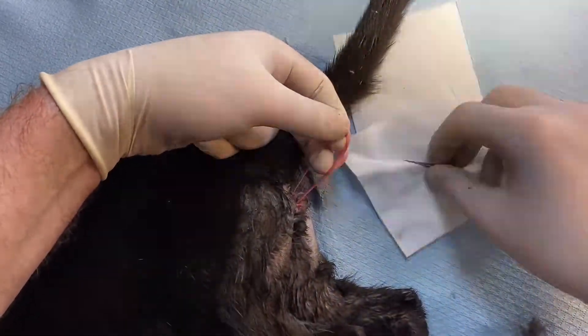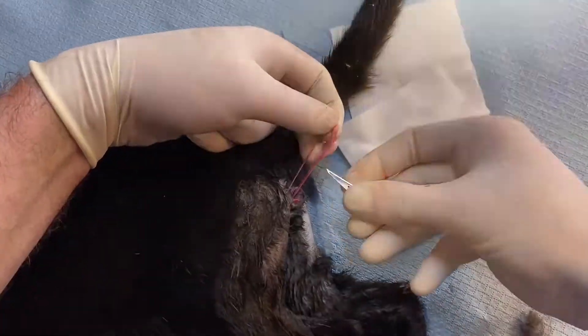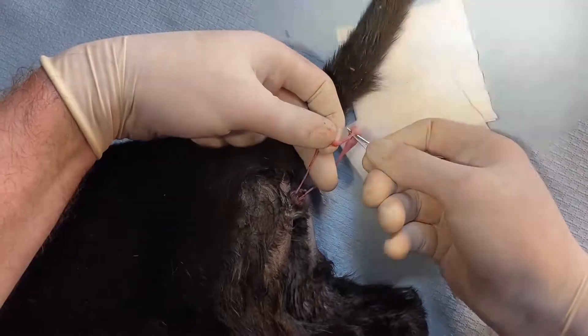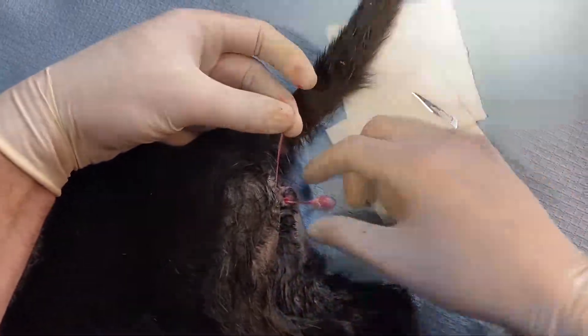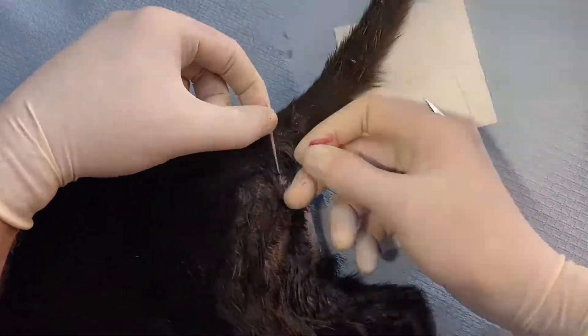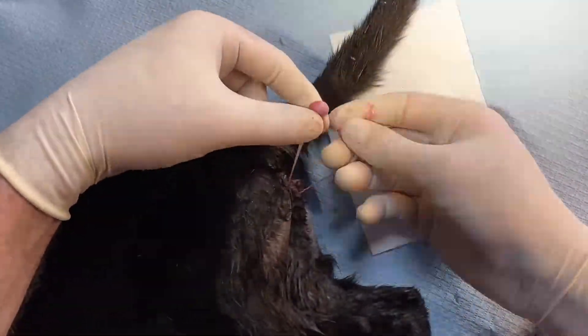I tend to keep the epididymis on the cord to give me extra length. You can either break it or you can actually nick it with a blade. Then we just put our ties in and make sure they go in nicely.